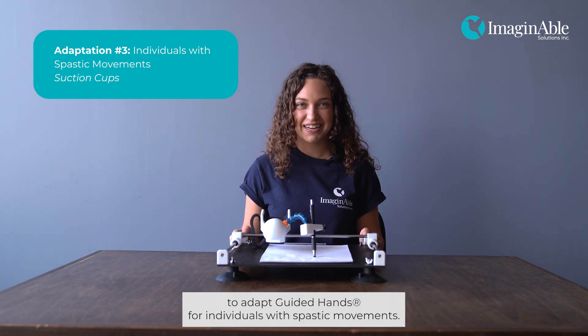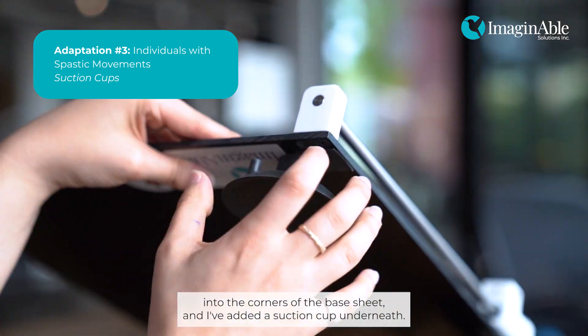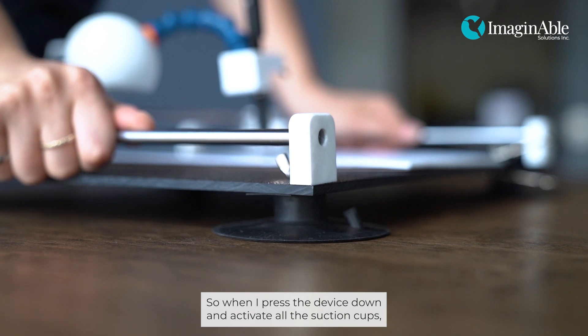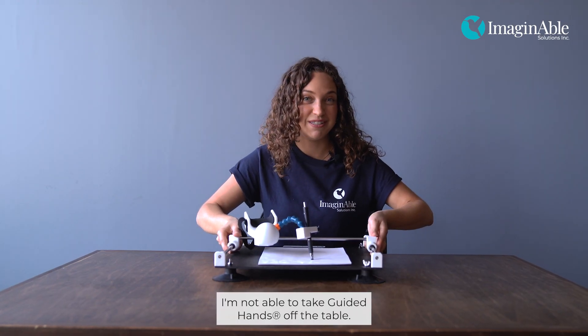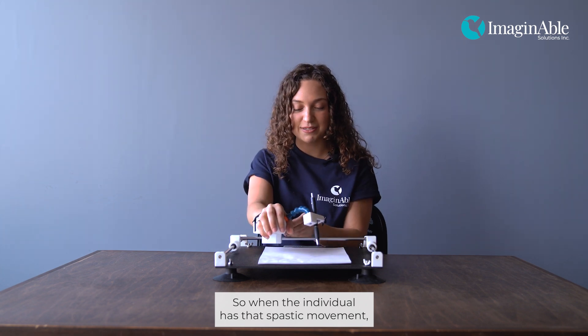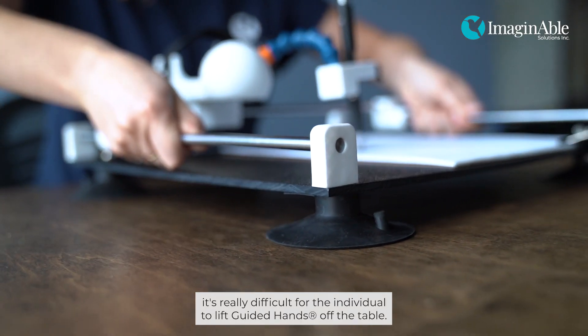Suction cups are a great way to adapt Guided Hands for individuals with spastic movements. I've drilled four holes into the corners of the base sheet and added a suction cup underneath. When I press the device down and activate all the suction cups, I'm not able to take Guided Hands off the table. So when the individual has that spastic movement, it's really difficult for them to lift Guided Hands off the table.